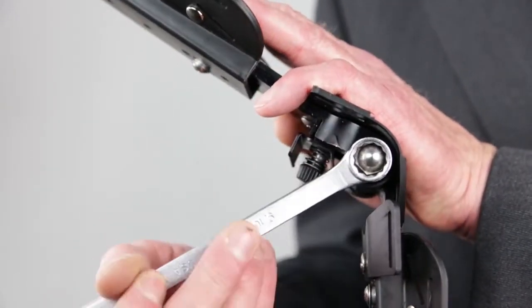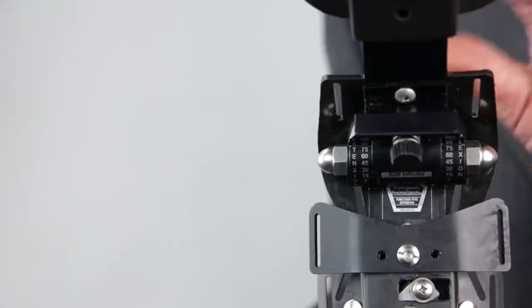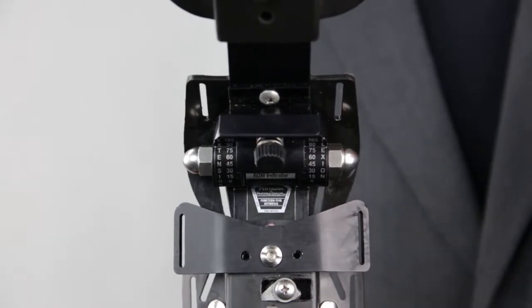Then, with the enclosed wrench, turn the chrome nut on the right side of the brace clockwise until tightened. Note that the red line indicator will be obscured depending on the flexed position.